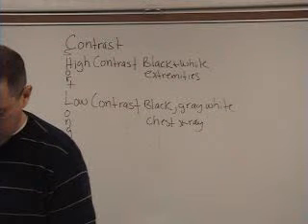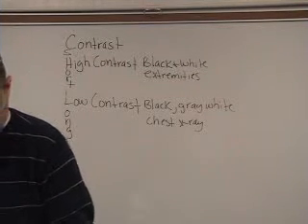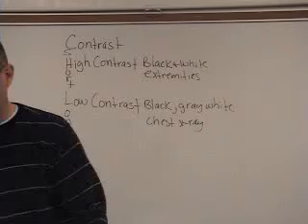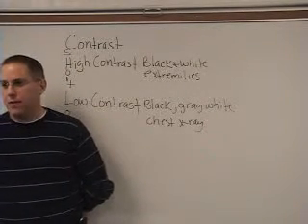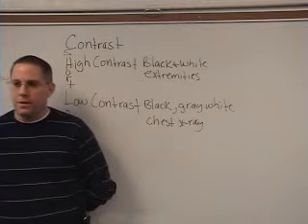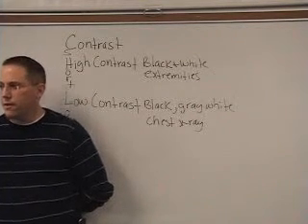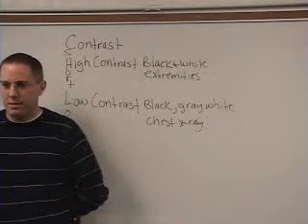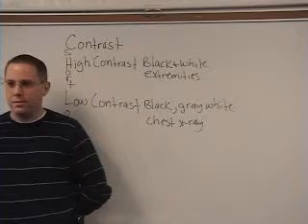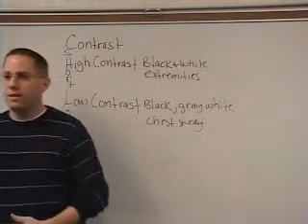All right, on page 108, it also mentions geometric properties. In other words, you can actually take an x-ray of a body part and it'll appear either blurry or it could appear larger or smaller than it actually is. If the patient is moving when you hit the exposure button, you're going to have a blurriness or a fuzziness on the x-ray.